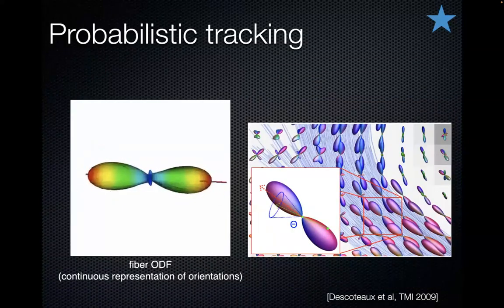A recommendation nowadays is to use probabilistic tractography. So instead of always picking the principal vector, the V, you actually sample your data to exploit the variability in the continuous modeling, and so you can get a bit more spatial coverage without losing yourself.